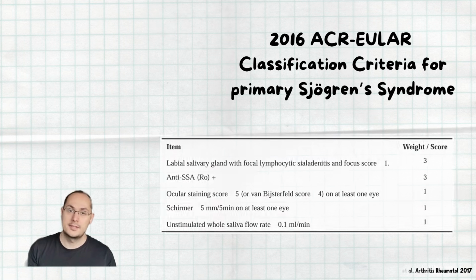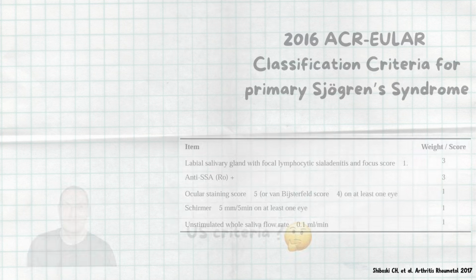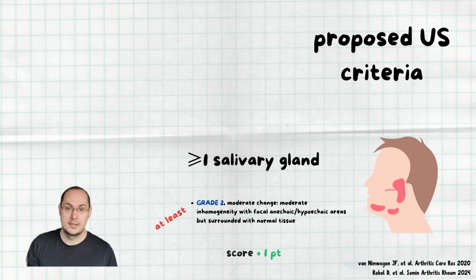Although ultrasound is not currently part of the 2016 ACR EULAR classification criteria for primary Sjogren's syndrome, there are multiple studies which proved that adding ultrasound to the current criteria can improve sensitivity. The proposed ultrasound criteria in these studies is an OMERACT score of at least 2 in one or more salivary glands with a weighted score of 1.